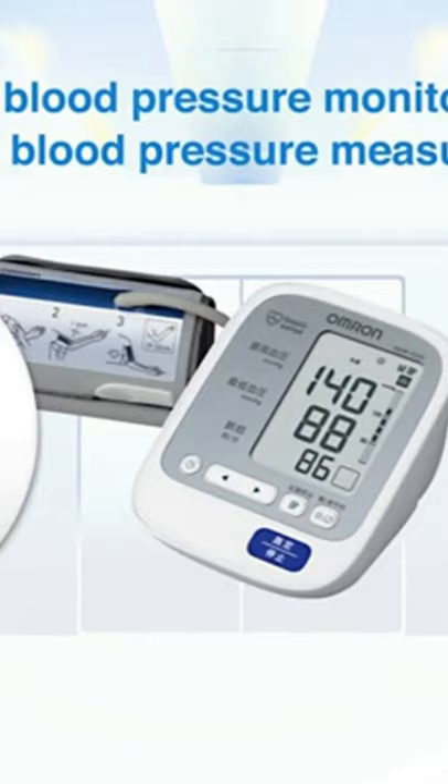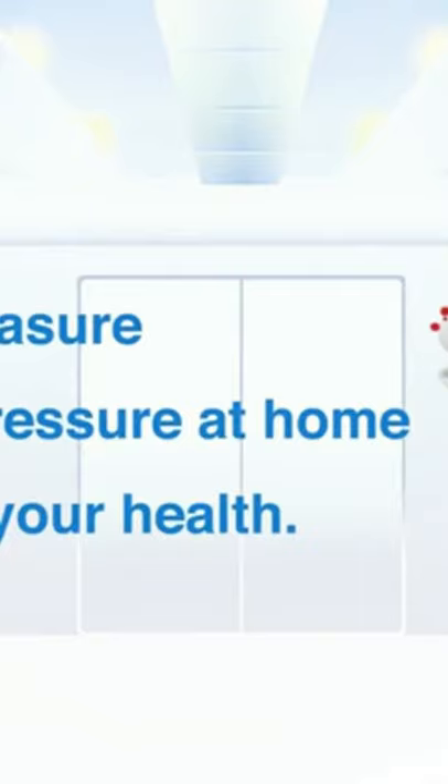Omron's blood pressure monitors are ideal for home blood pressure measurement. Get accurate measurements by simple and easy operation, and automatically record daily measurements.